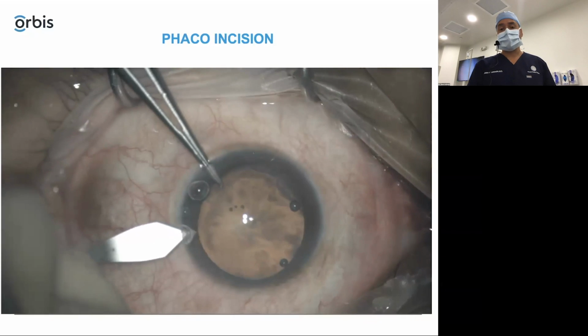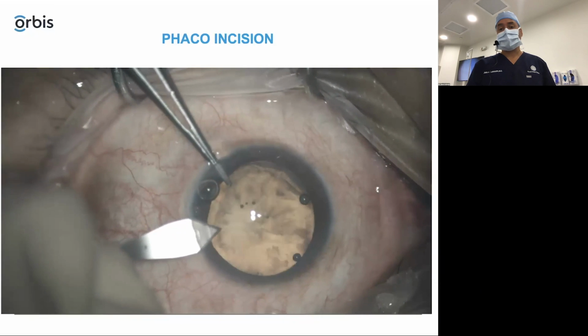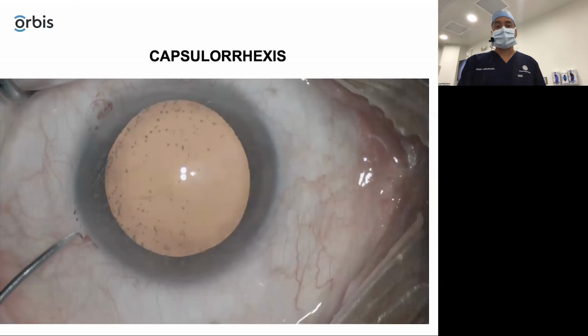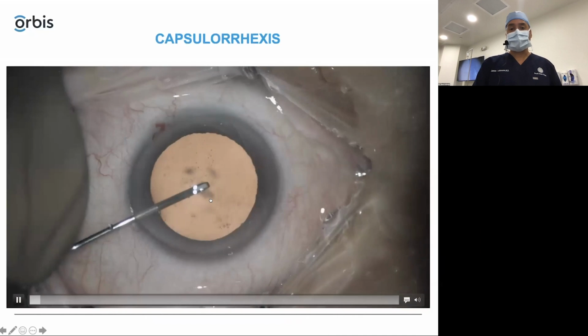Again, in slow motion here, you kind of go in and you want it to be like a square. That's what you want. You don't want it too long and not too short. Okay, the next step is the capsular rhexis. And so we'll start the video here.